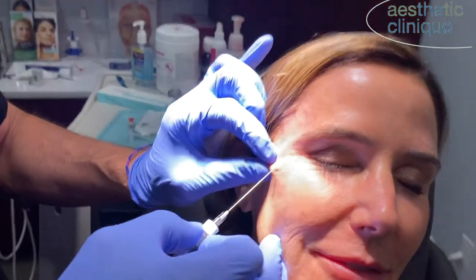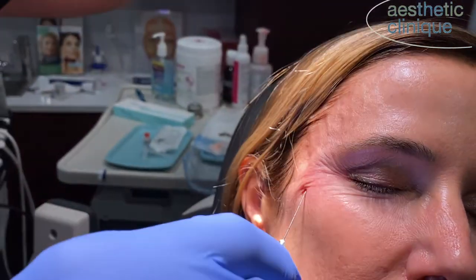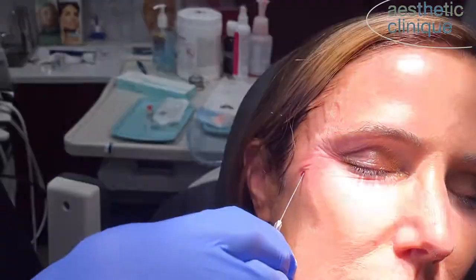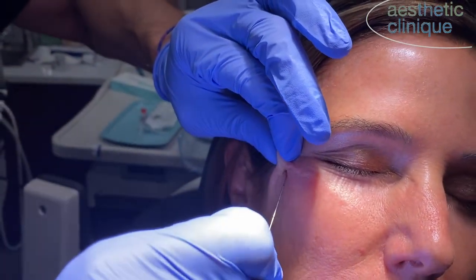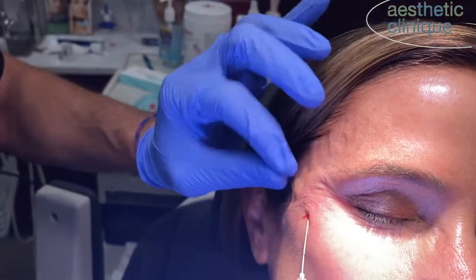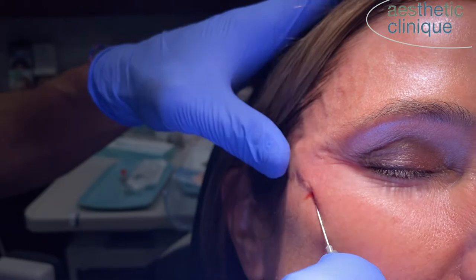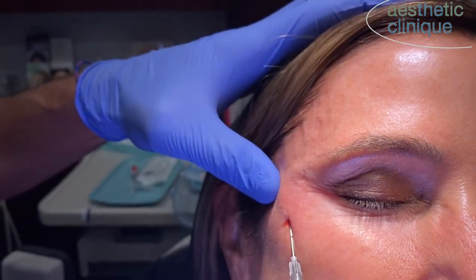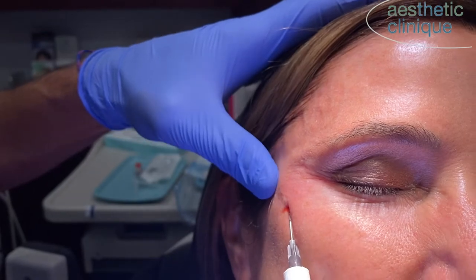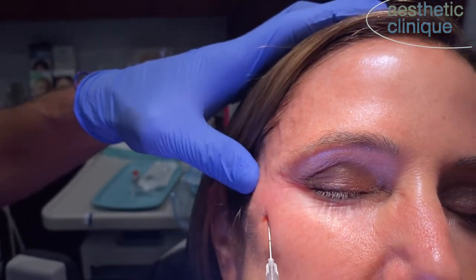There's a little bit of space right there that I need to get to. Again, I'm going to pop through the SMAS — there's a little bit. And now I'm through the SMAS. Now I'm going to go back here and inject a little bit back here, back to the hairline.